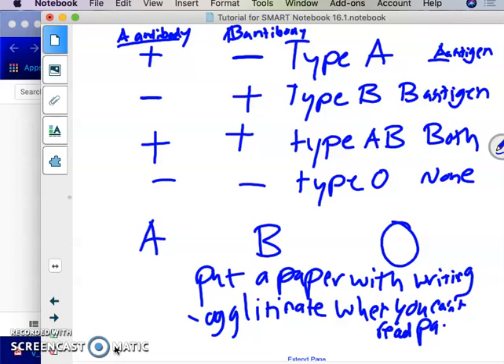All right, and you guys can always verify your blood types. Once you've blood typed everybody, you can verify your blood type with it. Your goal is to try to figure out whose blood might have been at the scene. You might not be able to narrow it down to one person, but you should be able to cross some people's blood out. All right, that is it. Oh, make sure you clean up your supplies when you're done. Wash off your tubes and stuff.